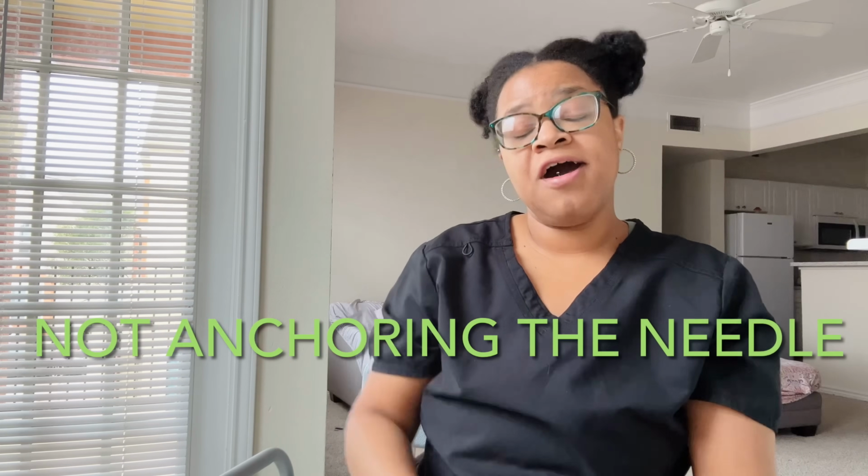Number 4 of a common mistake is not anchoring the needle. So not anchoring the needle just pretty much goes on not having a really firm and steady hold of the needle. This can happen as a new phlebotomist. Maybe you're a little bit scared or nervous. A lot of that anxiety is heading your way, and pretty much you're not really holding that needle real steady, real firm. And this can cause a miss of the vein because you didn't anchor it.